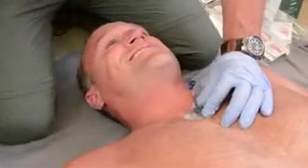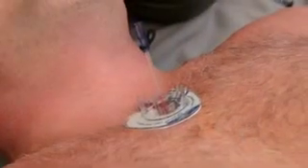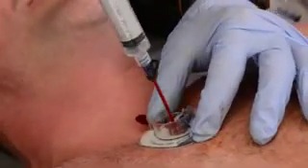This user-applied force will power the device to pierce the skin and seat the tip of the infusion tube into the cortical bone of the manubrium. Follow your medical direction and control for this next step. Before hooking up the IV line, it is recommended that you aspirate marrow and flush to clear the tip of the infusion tube.